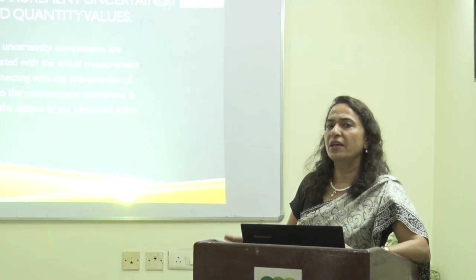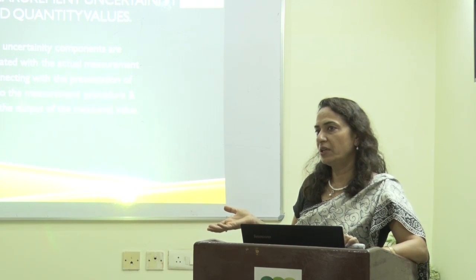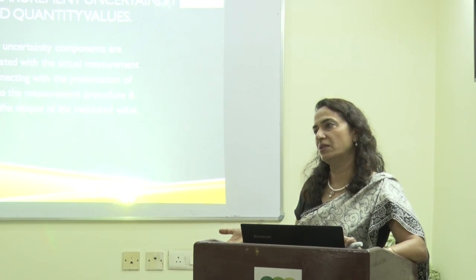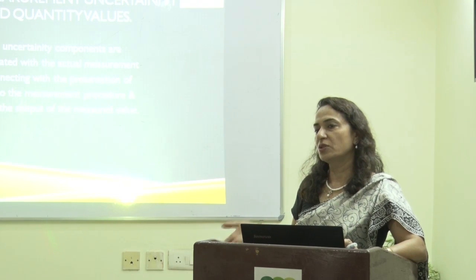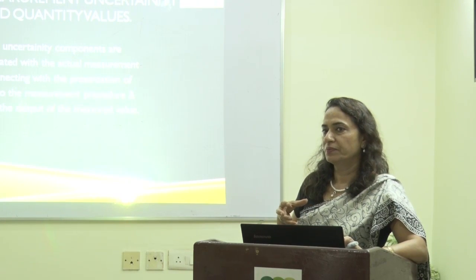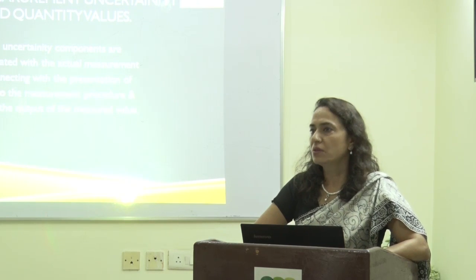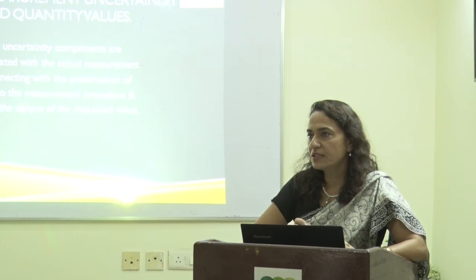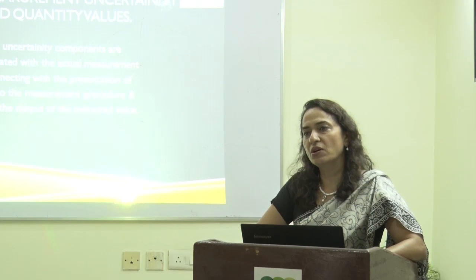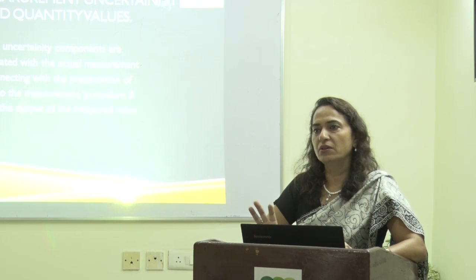CLIA guidelines are very, very liberal, broad. When you do it in your daily routine, your CV percentages are much better than the CLIA guidelines, because with automation, CV percentages have become narrowed. So should the CV percentage be high or low? Which is good? CV percentage should be low. The lower the CV percentage, the better is your result. Right? So it is a variation which you are allowing.